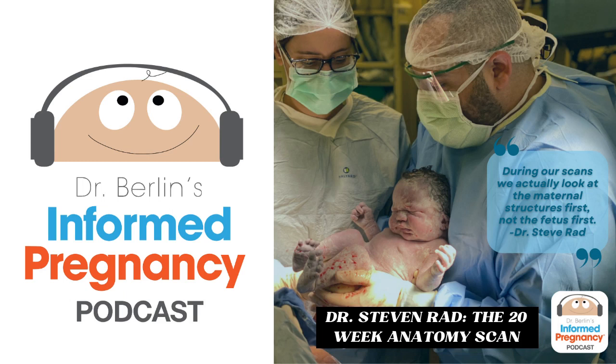So from there, then you go head to toe, or you go feet up, and you go in order. And if you can't see something, you move on and skip it and come back, or you stay in order. You do not move around. Classically, students or new OBGYN residents or sonographers or people who don't do ultrasound often are just randomly looking around for a leg or a face or a head. We don't do that. We start in order.